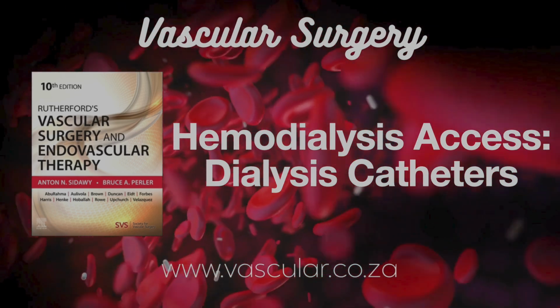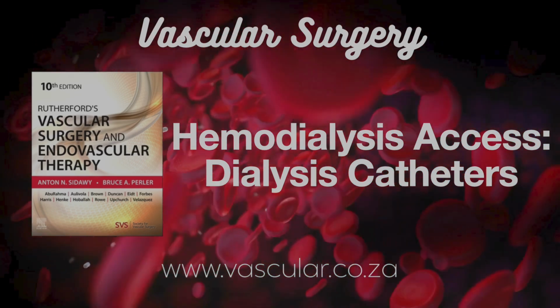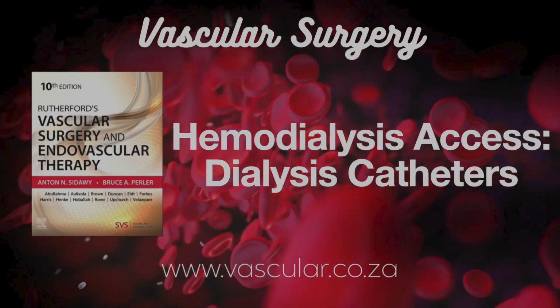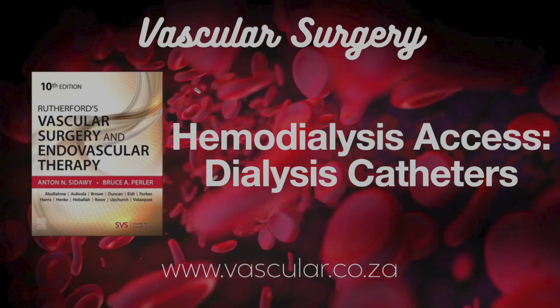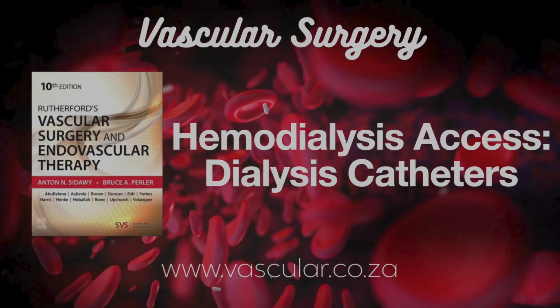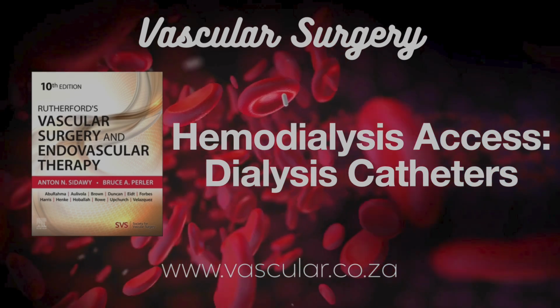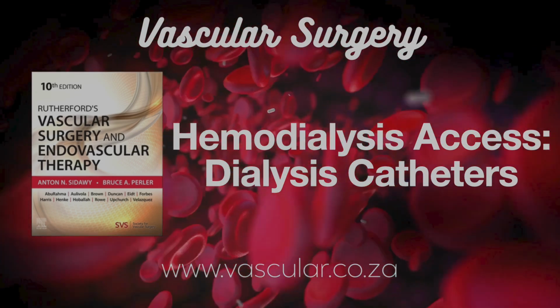Okay, so you have two lumens, right? An arterial lumen pulls blood out to the dialysis machine, and a venous lumen returns the clean blood back to the patient. Got it. Recirculation is when some of that freshly clean blood coming back through the venous lumen gets immediately sucked back into the arterial lumen, going back to the machine without circulating through the body first. So it's like cleaning the same blood twice instead of getting the dirty blood. Reduces efficiency. Exactly. It makes the dialysis less effective because you're not clearing waste products from the whole bloodstream as efficiently. So how did the designs try to prevent that?